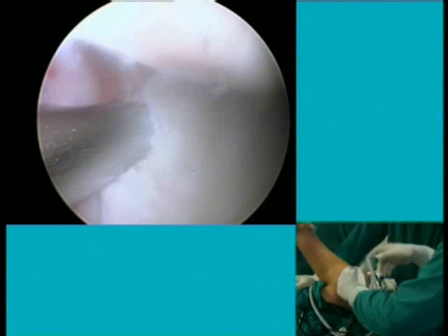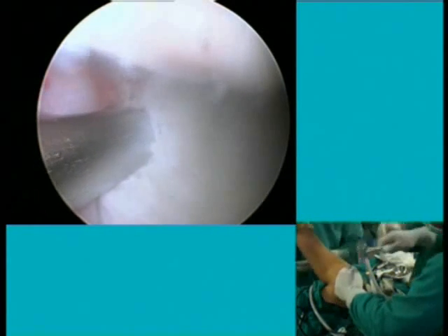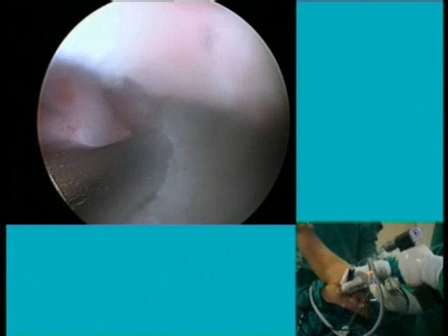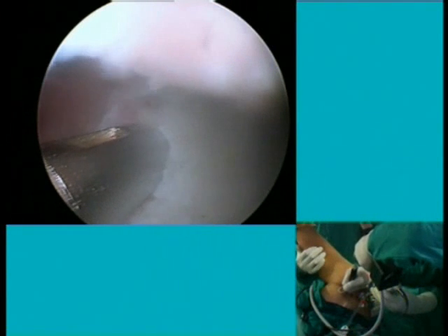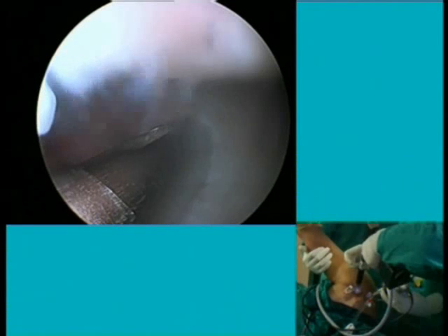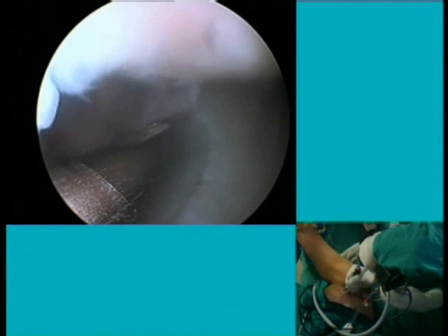Just a tap. Mallet, please. Okay, and then I'm going to drill. Okay, that's it. If the cameraman can focus right there, there is a laser mark, and you don't need to see inside.